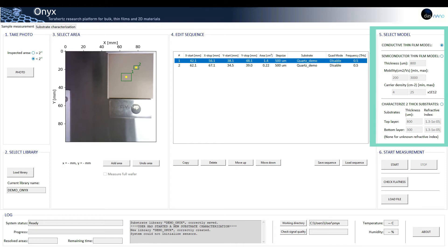Section five: select model. Once we have chosen the inspection parameters, the user must select the applied model, depending on the samples he or she wants to inspect. Three options are available.